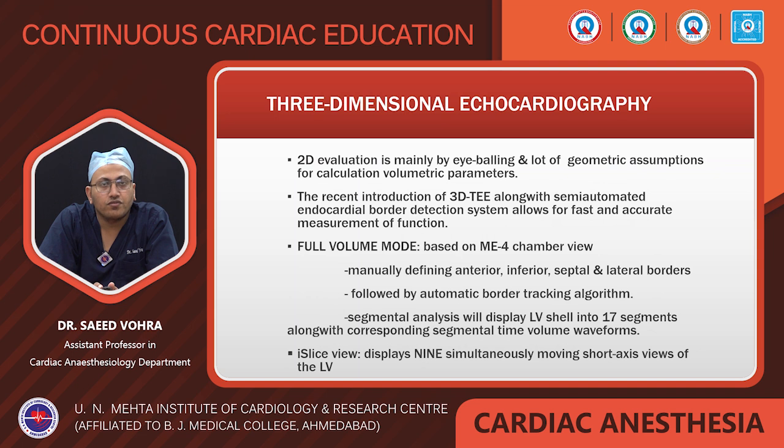Three-dimensional echocardiography for regional ventricular function. 2D evaluation is mainly done by eyeballing, and a lot of geometric assumptions have to be made for calculation of the volumetric parameters. The recent introduction of three-dimensional TEE along with semi-automated endocardial border detection systems allows fast and accurate measurement of regional ventricular function.